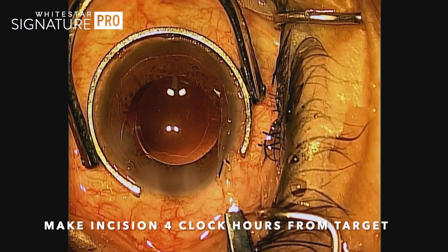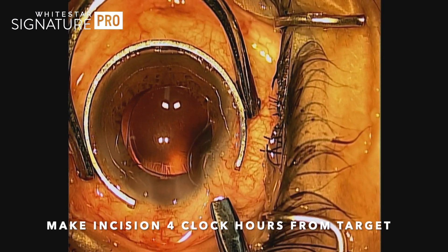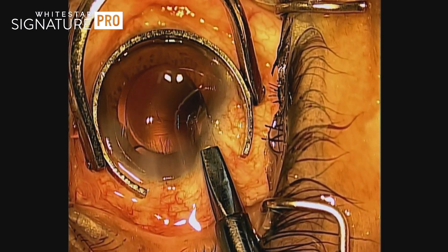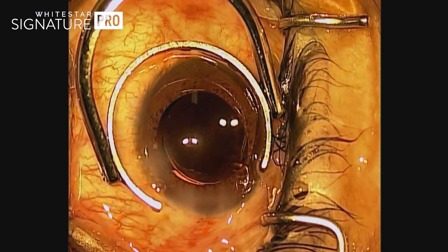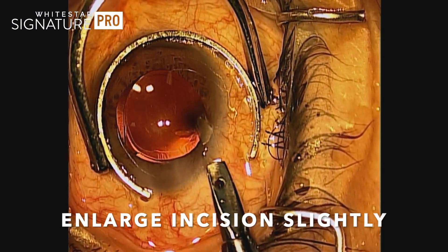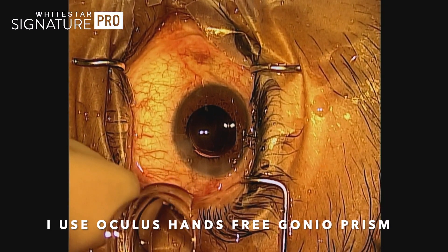So here we go. You make your incision about four clock-hours away from the target where you're going to implant the Hydrus in the angle. Here's a side port incision — you really do want to go away from the main temporal incision. I like to reverse cut the internal aspect of the incision to give myself a little more flexibility, and it will still seal very nicely.